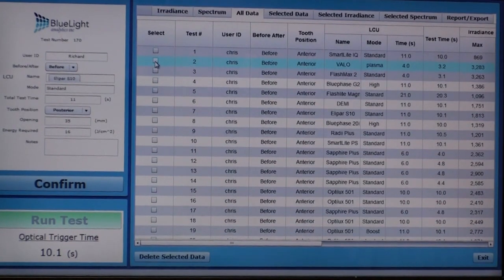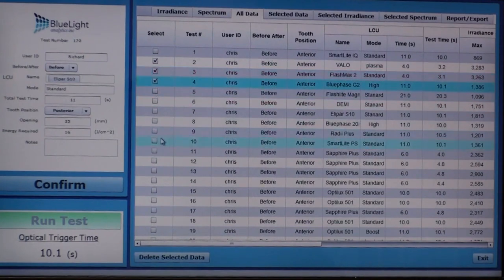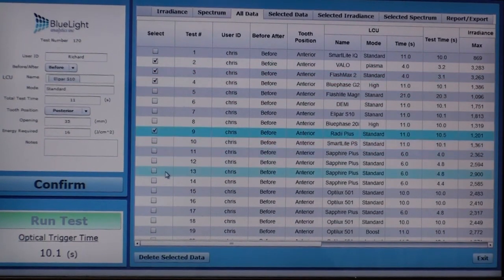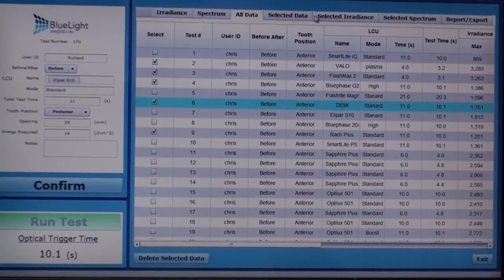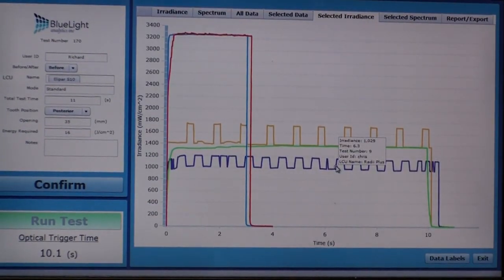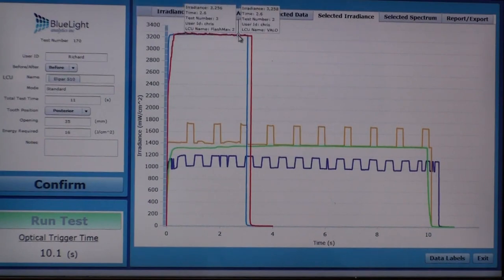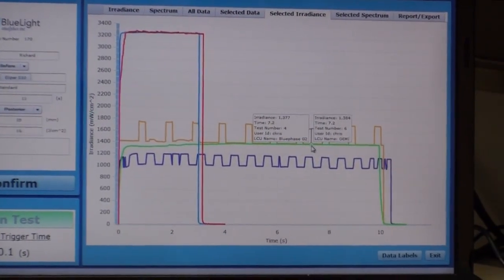We're now going to look at what there is in the data tab. When you click on the data tab, you can see all of the data that has been collected by operator, by light, and we can see differences, and we can now graph those as well by selecting the irradiance tab. Here we can see the irradiance delivered by the selected lights. We can see some lights only used for 3 seconds, some are used for 10 seconds, some pulse. When you hover over the line, we actually can see the irradiance delivered.